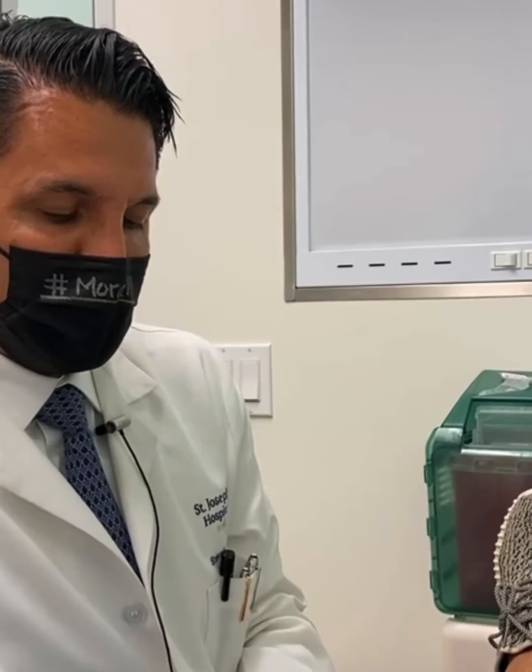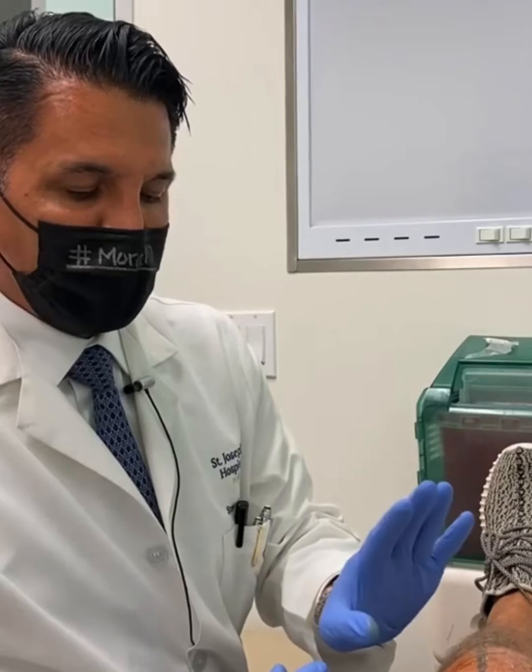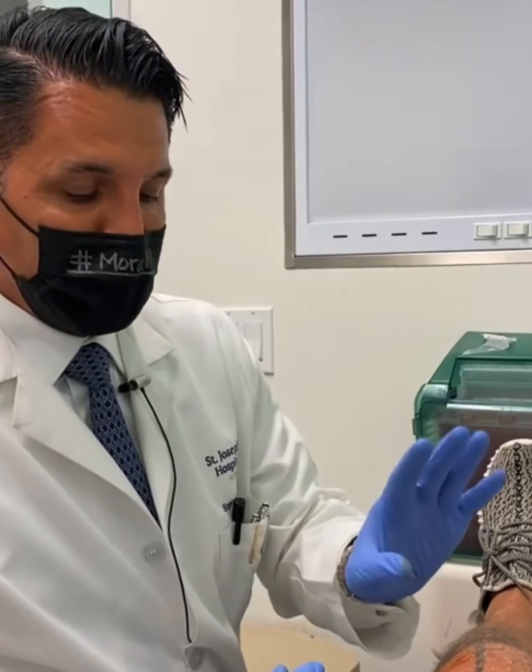See how easy it's going in? Are you feeling okay? No pain at all. See, that's because it's going right into an empty pocket — the knee, okay? Just like this. Bada-beam, bada-boom.